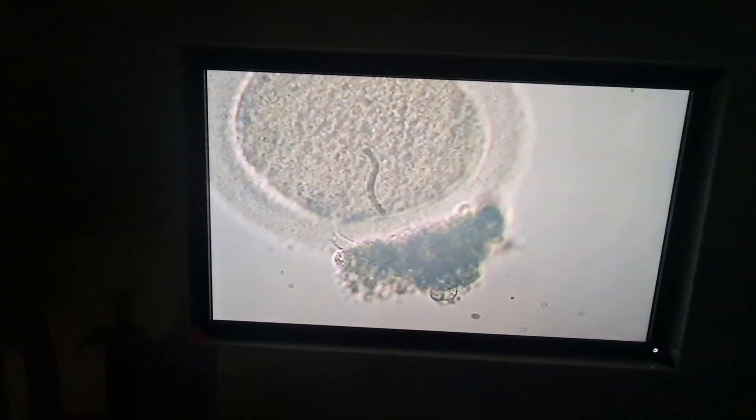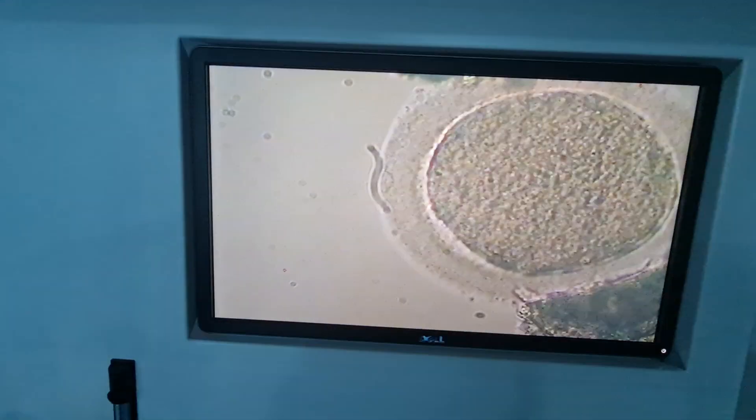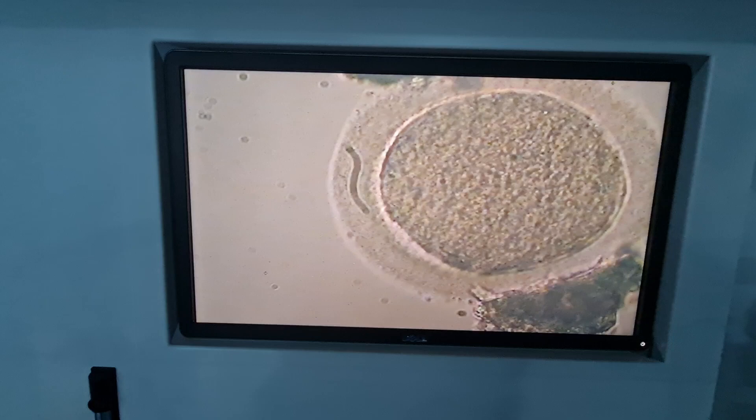And this small clump of cells, these are granulosa cells. And we have denuded the oocytes, so you can see the zona and perivitelline space.